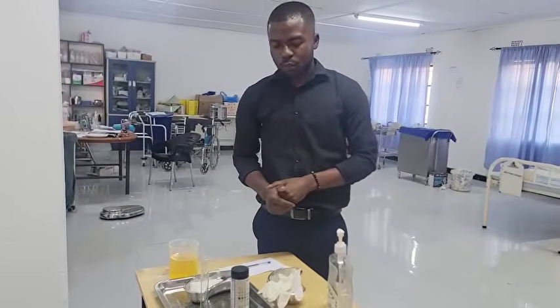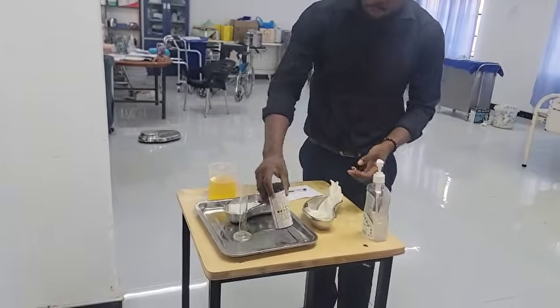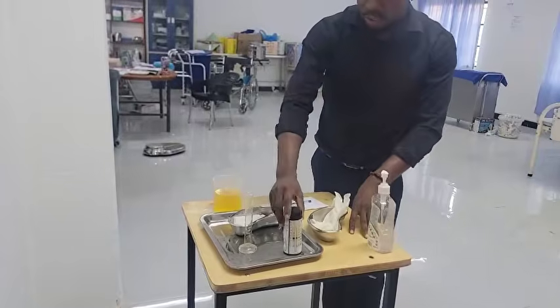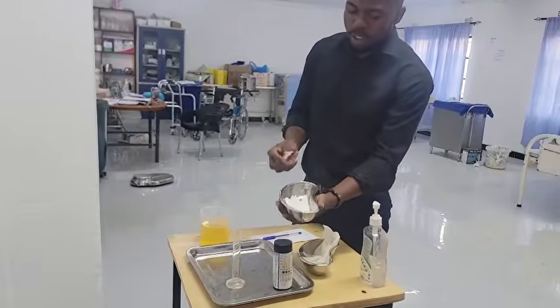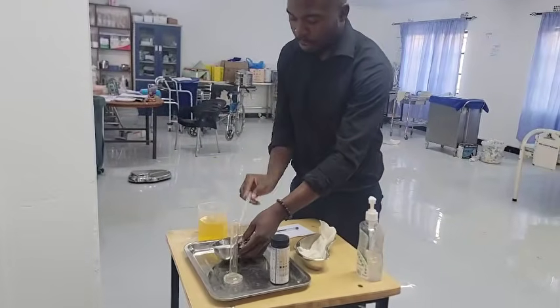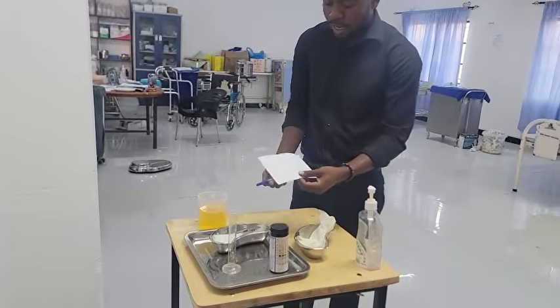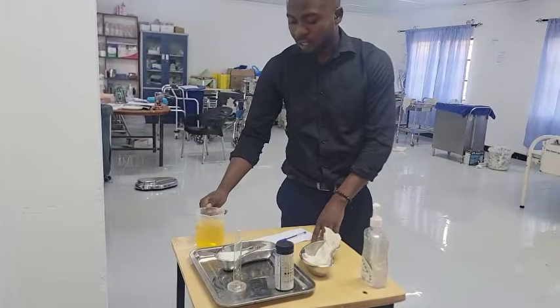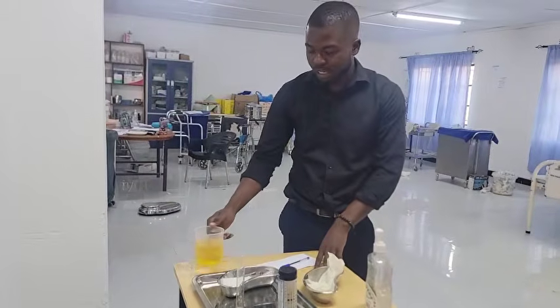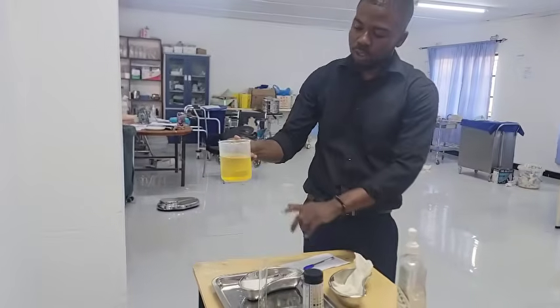Yes. So, what are the requirements of this procedure? On the station, you are going to find clean gloves, the bottle containing the multi-sticks. You are going to find a receiver with the tissue and the pipette or the dropper. And then you are going to find the test tube, a piece of paper and a pen where you are going to record your findings. And you are going to find the urine on the station in the jug. So the jug has graduations where you have to read the amount.